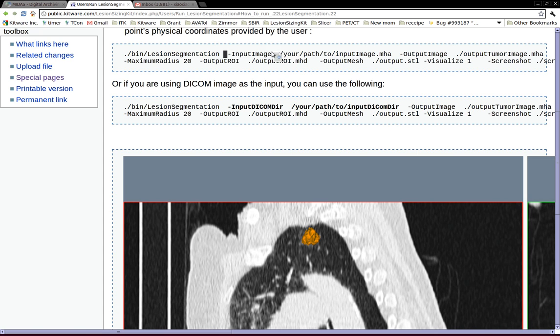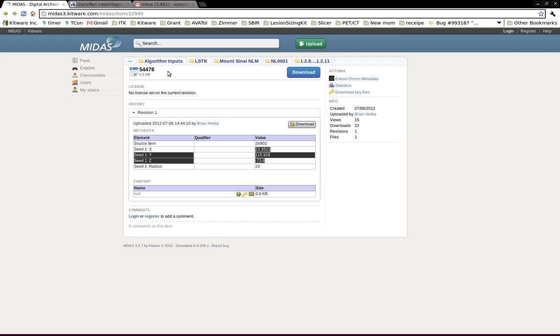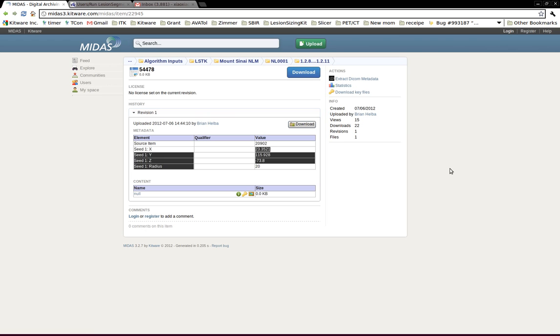I have already downloaded one dataset from this Open Science dashboard, and I also have the seed point that is extracted manually. I'm just going to use the parameters here and run the segmentation.